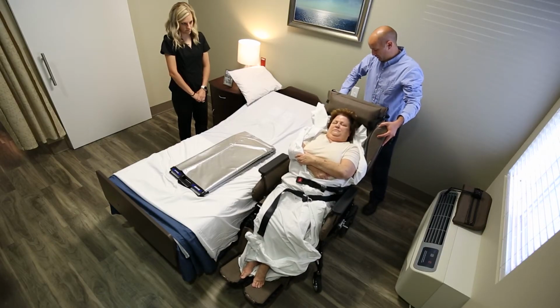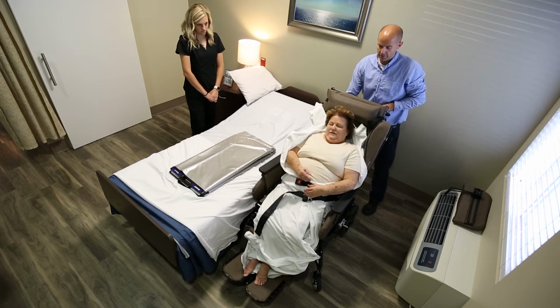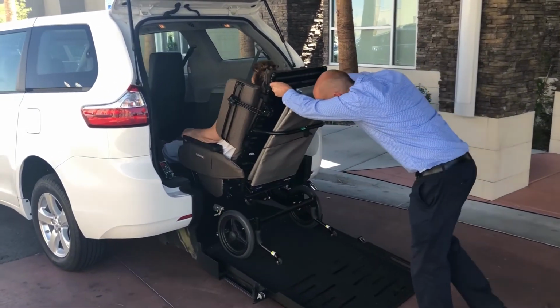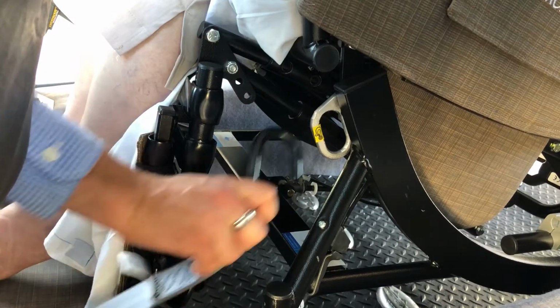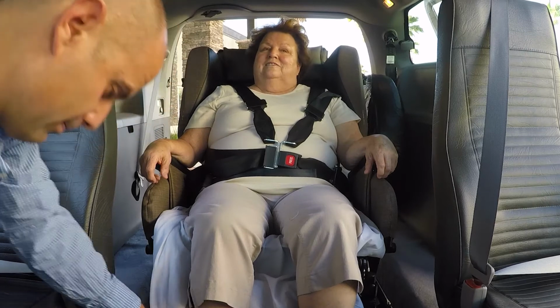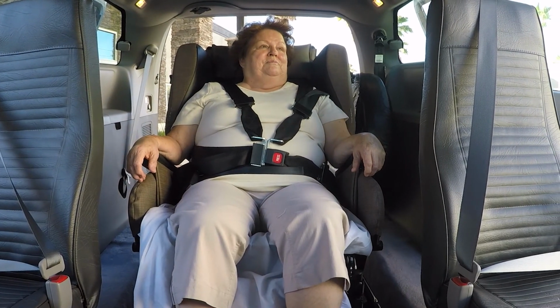We can put them in the seated position, and we can tilt them or recline them back, letting gravity pull them back into the chair, as opposed to being pulled forward out of the chair potentially. We can then secure them in the vehicle with designated attachment points that are part of WC19. Normal turning, braking, accelerating isn't going to affect them as much because they're not using trunk control to hold themselves up in a wheelchair. They're sitting back and reclining in a chair to where they're not using that energy to hold themselves up.